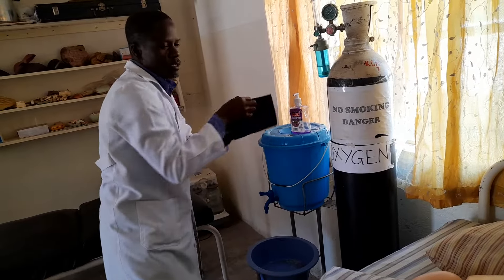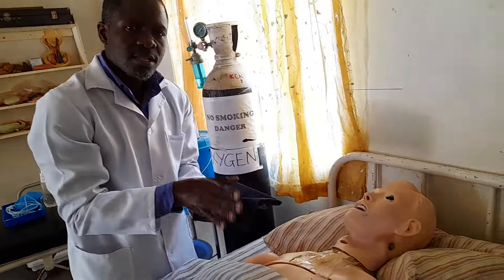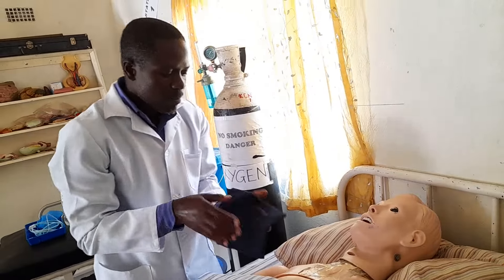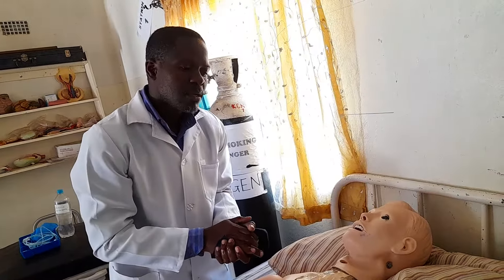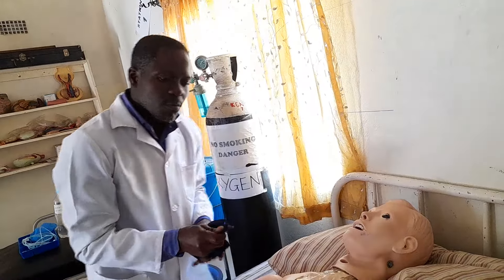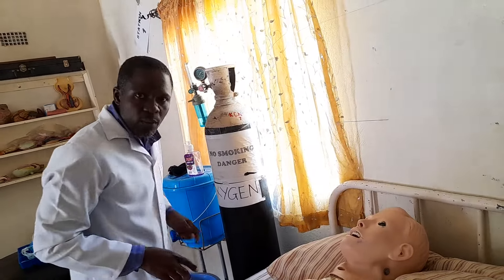Then you start drying your hands, get on to the patient, and greet the patient. Okay, good morning Mr. Mlinger, I am student nurse number two, I've come to administer oxygen to you. Please go ahead. Is there anything I can do for you before I begin? No.